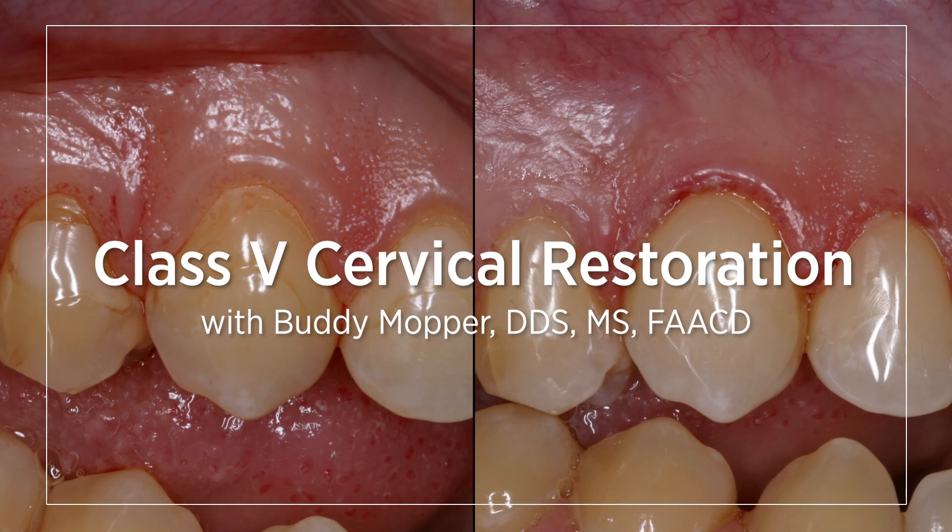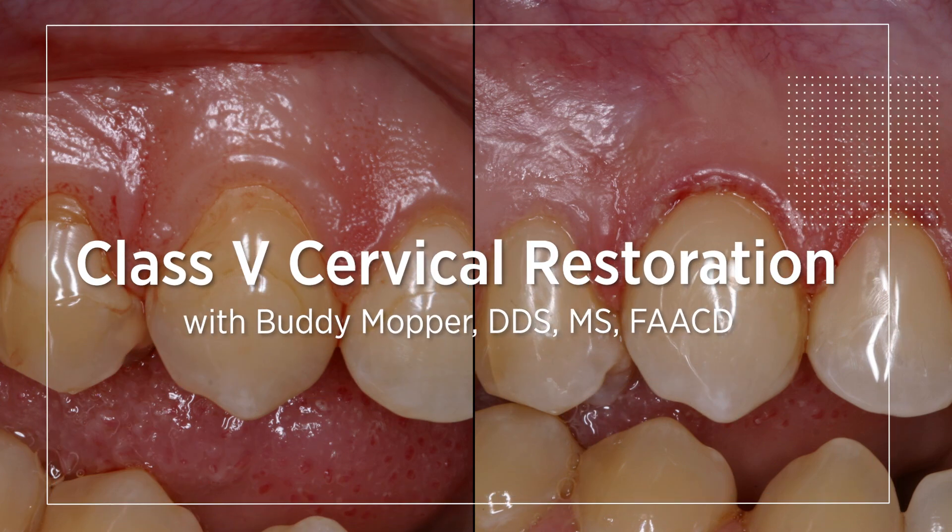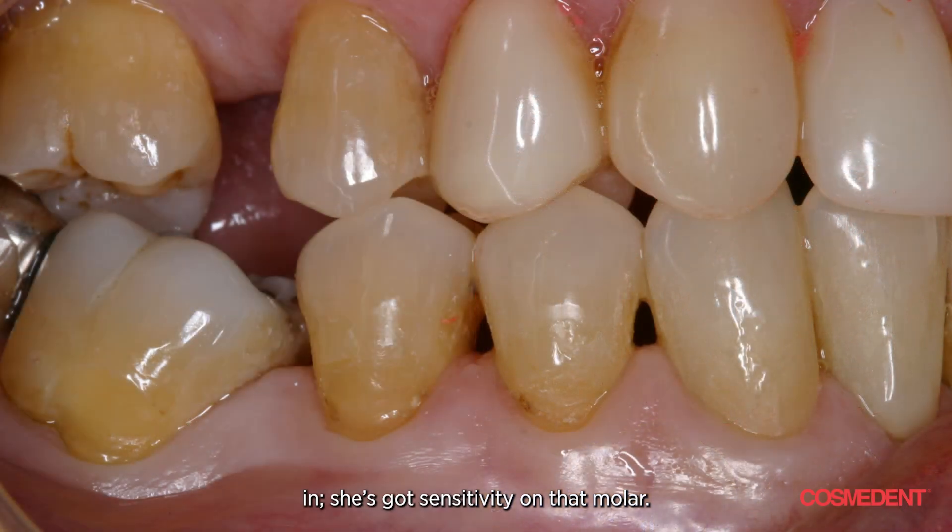Let's talk about cervical restoration. Here's a case: an older lady comes in with sensitivity on her molar, and she doesn't like the way the others feel. So we're going to take care of them. You've got three of them here — the two bicuspids and the second molar.